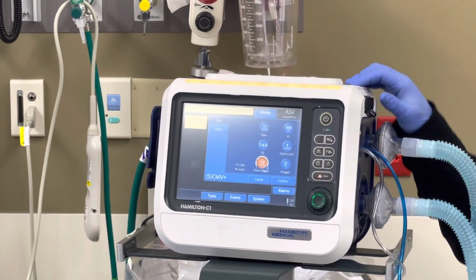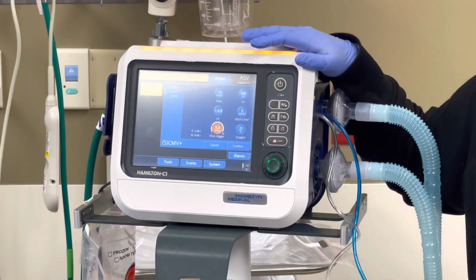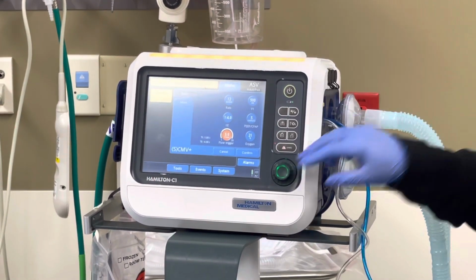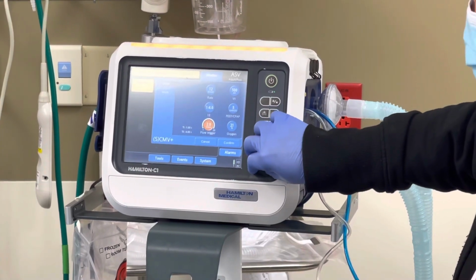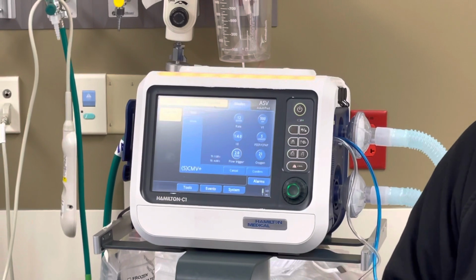Makes it a little bit easier for the patient to breathe. 5 can be a little difficult, especially when the patient starts to wake up. Okay, so I usually go down a little bit. And this is the flow that's required to trigger the breath.